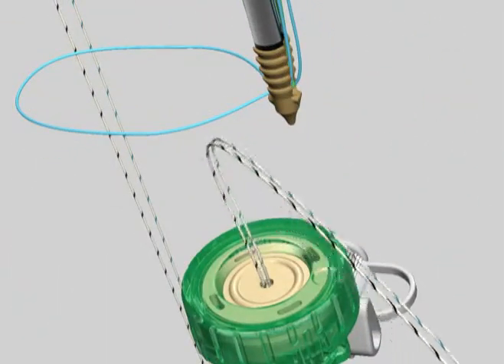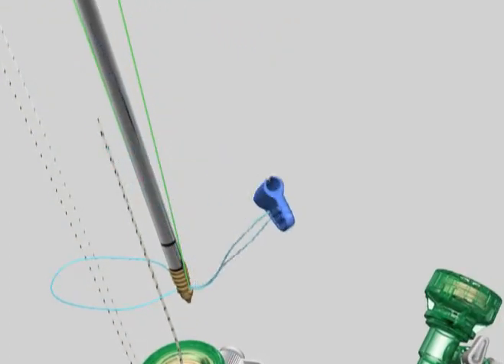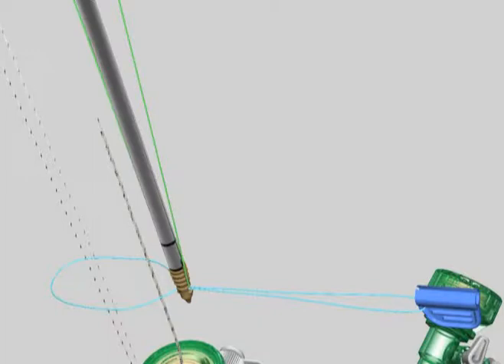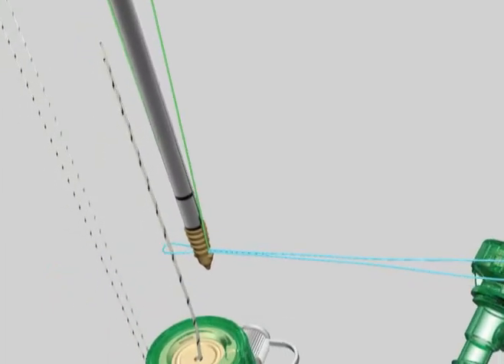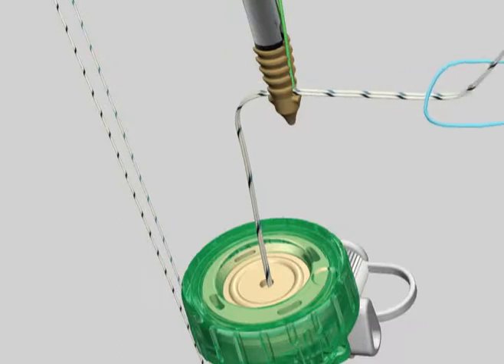Feed the two medial suture limbs through the suture threader loop. Remove the suture threader tab from the inserter shaft and pull it away to thread the two medial limbs through the hole in the footprint anchor tip. Discard the suture threader.